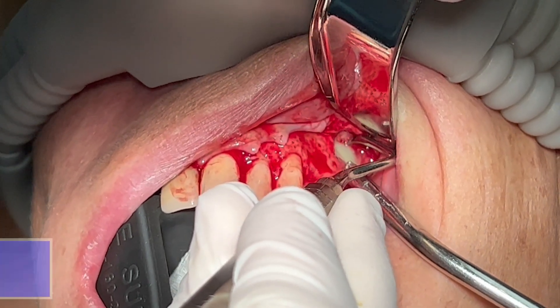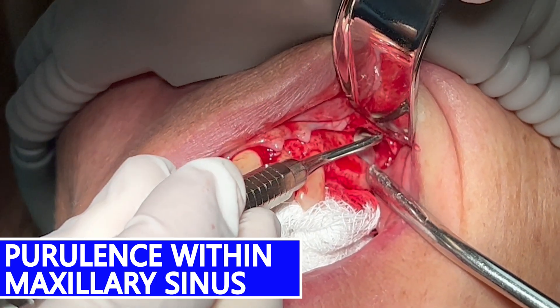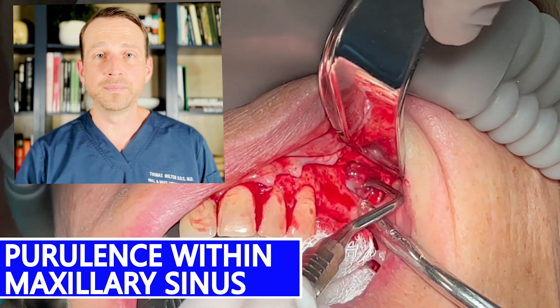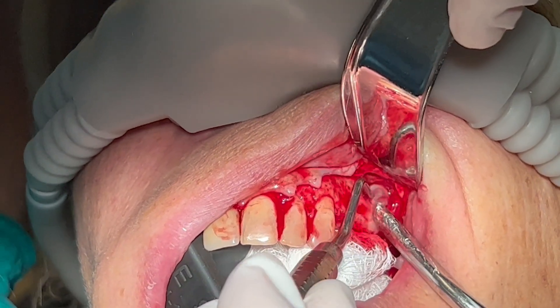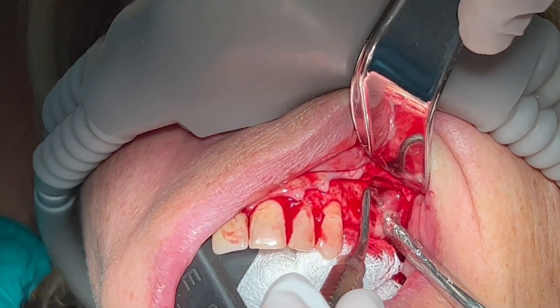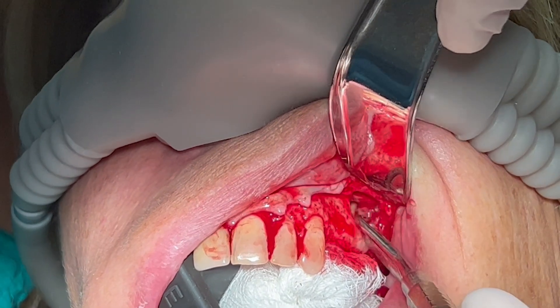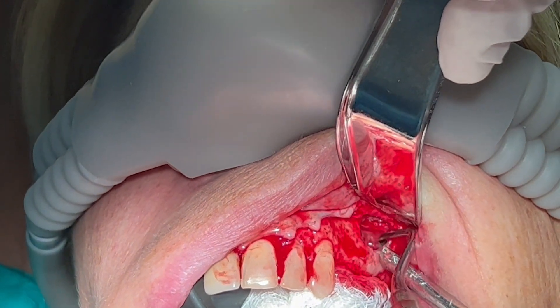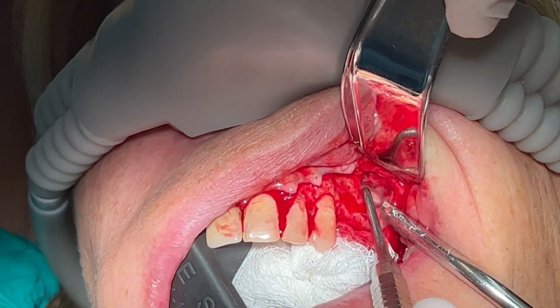As soon as I puncture the membrane, there's a large amount of pus. Here's the purulence pouring from the sinus, and there's a large amount of it. Clearly this has been infected for a long time. There's a lot of granulation tissue here.